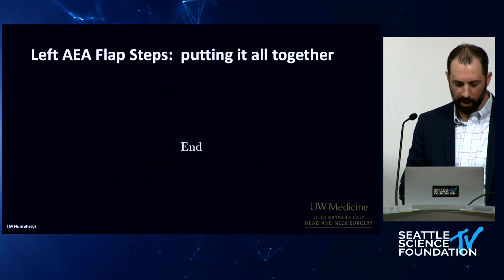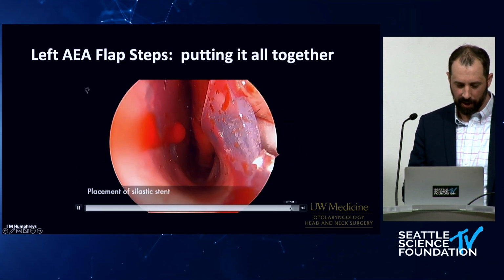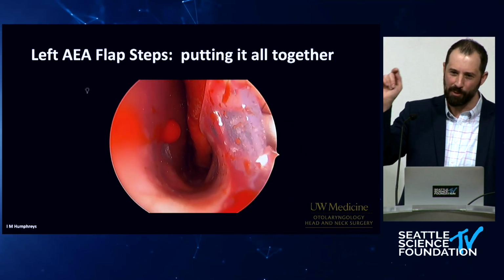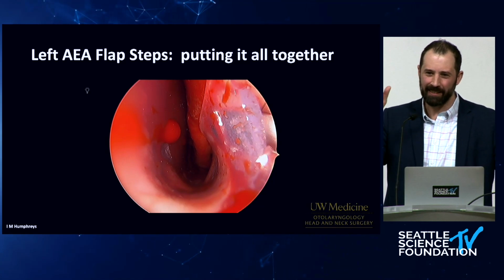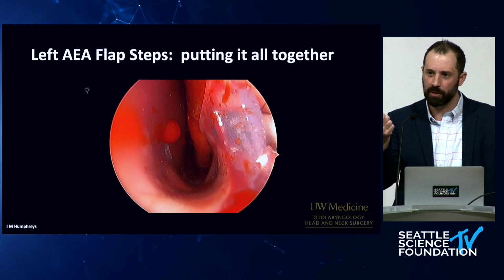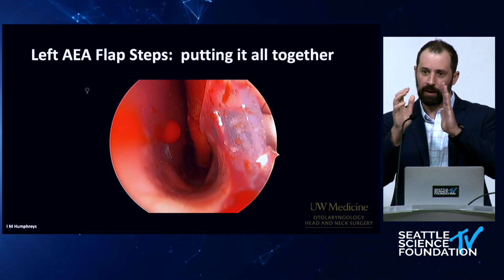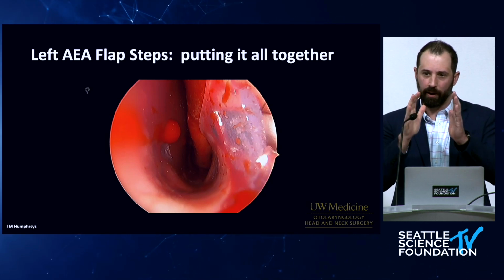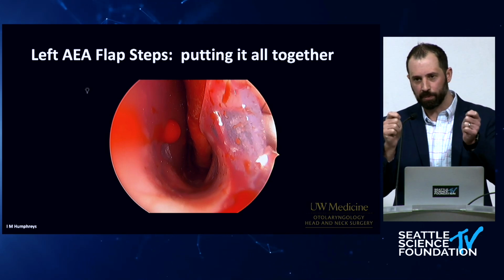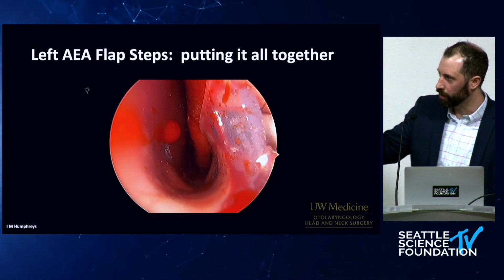One pause on the placing of the silastic is I definitely have had times where putting the silastic in, I've moved my dang graft. So take a moment, just really make sure you're holding on to the silastic stent. Even though your flap is sutured, really recognize that you have a multi-layered repair, trying to get it to sit in the area that you want, and then putting the silastic splints on both sides, and then putting whatever suture you want through, just like you would for Doyle splints, is really the key.